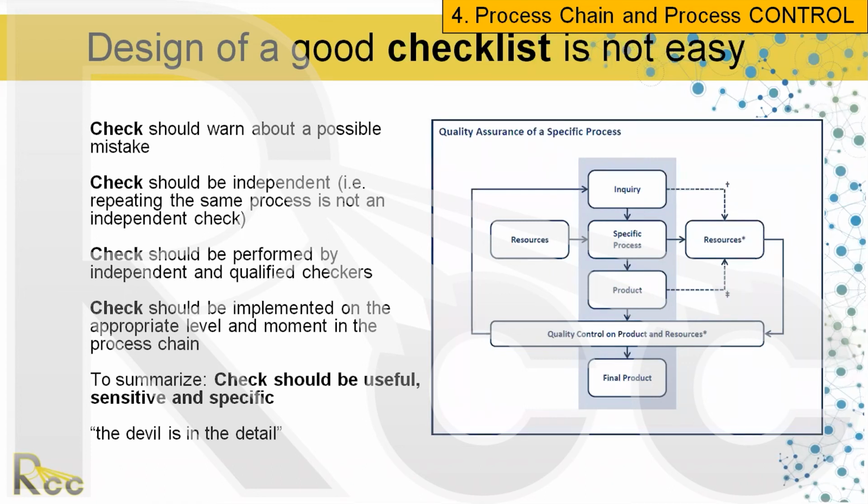There's a lot of literature on building checklists, but it's not easy, and they can bite back. You don't want people to get fatigued by checklists, but each check should be thoughtfully designed. And like I said, there's actually a report on this. But this is done in a team fashion. You shouldn't have physicists writing checklists for nurses without nurses' input. That's just a recipe for disaster. You should be discussing these things together. And whoever is implementing the checklist really should be a part of the process of developing it. So that takes effort, and that should be done together.